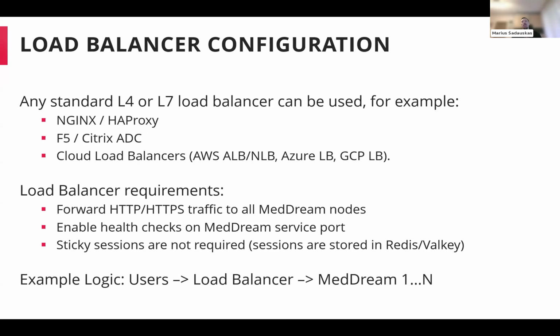For the load balancer, just some information, but as mentioned, mostly all load balancers would suit your needs. In principle, what it needs to do is just to be able to forward HTTP or HTTPS traffic to MedDream nodes.